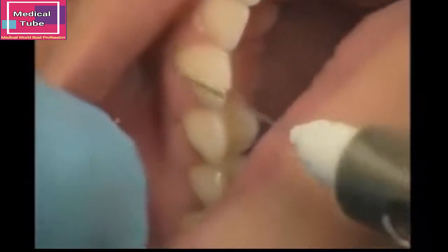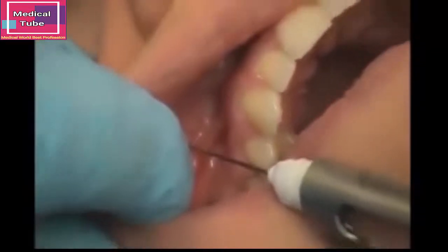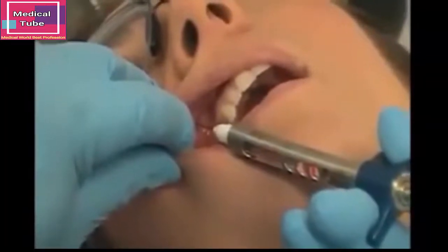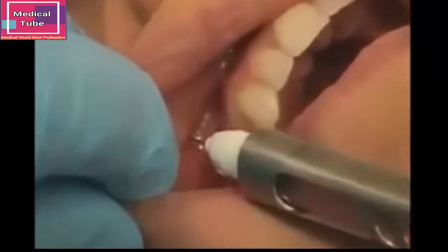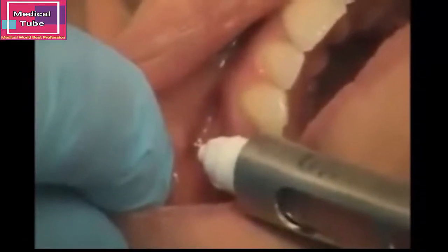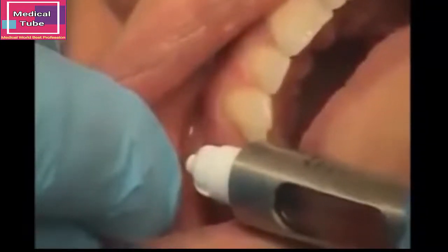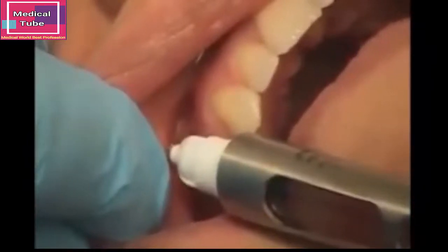Pressure anesthesia is to maintain a firm pressure with your finger over the injection site both during and at least for 1 minute after the injection to increase the diffusion of anesthetic solution into the infraorbital foramen. The depth of insertion is 16 millimeters, or about half the length of the long needle. Gently contact osseous. Aspiration potential is 0.7%. Negative aspiration. Amount of solution is very slowly, 0.9 to 1.2 milliliters, or about half to 2/3 of the cartridge.